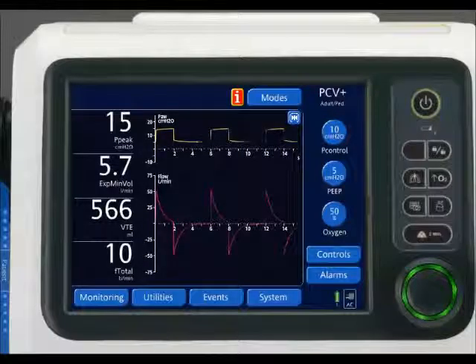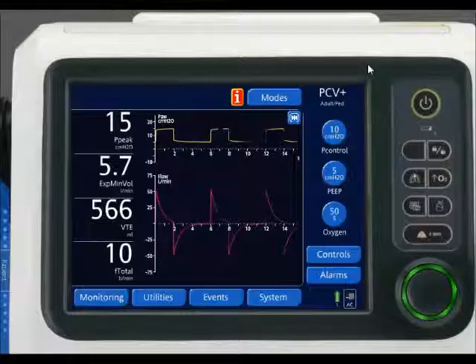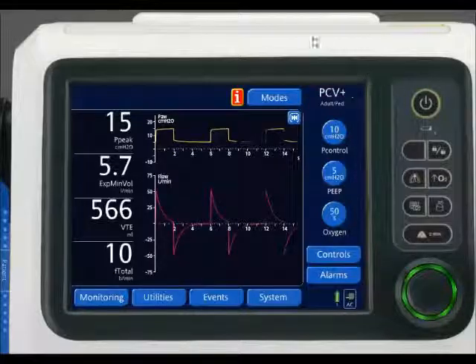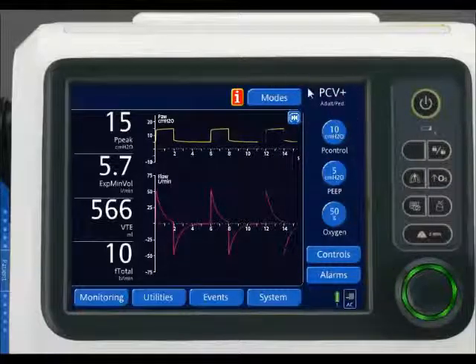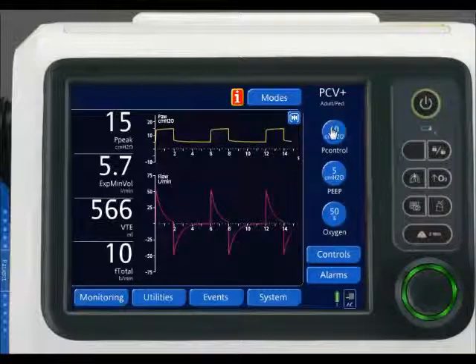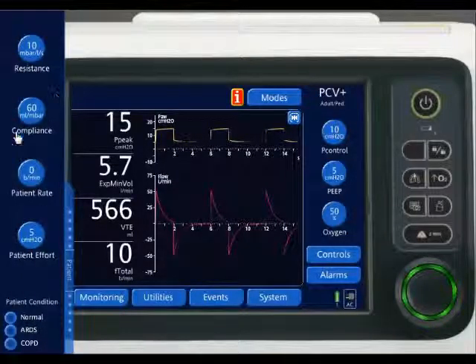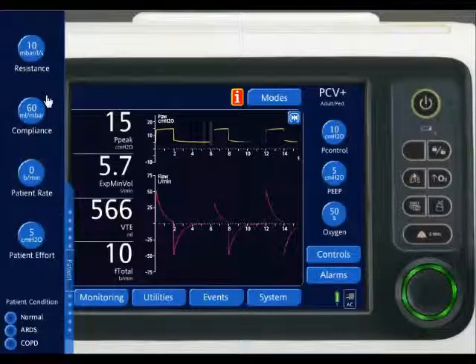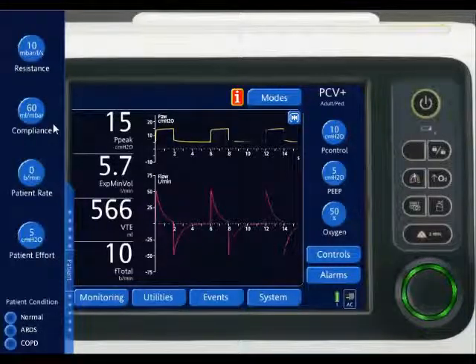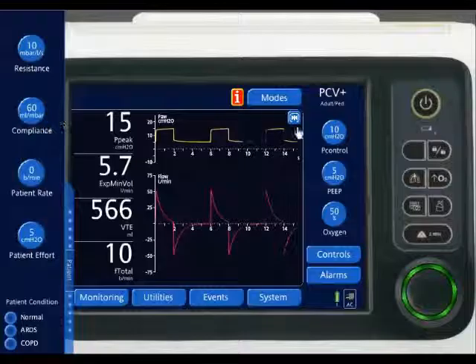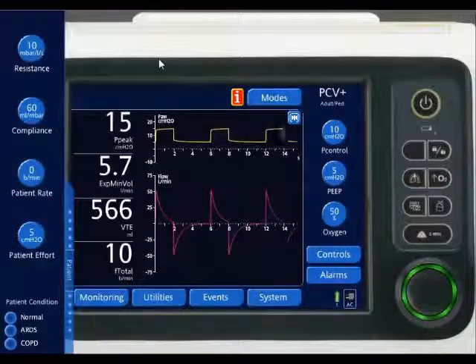Now this is my ventilator, and I have it set in pressure control ventilation with a pressure control setting of 10. The patient has a resistance of 10 and a compliance of 60. So with a patient compliance of 60, if I multiply that by 10, my max tidal volume attainable should be 600 — nothing above 600.